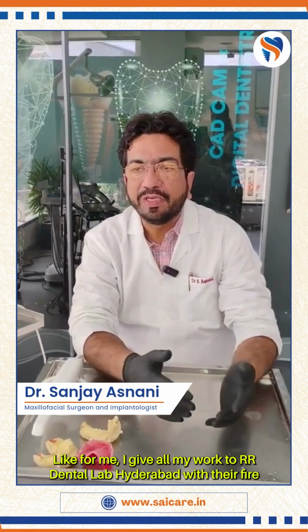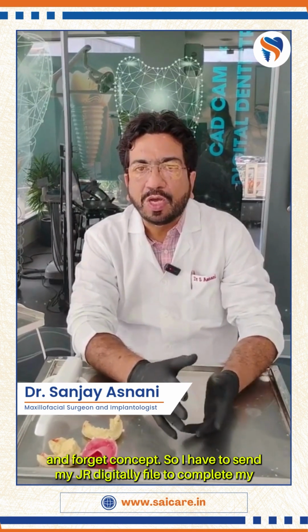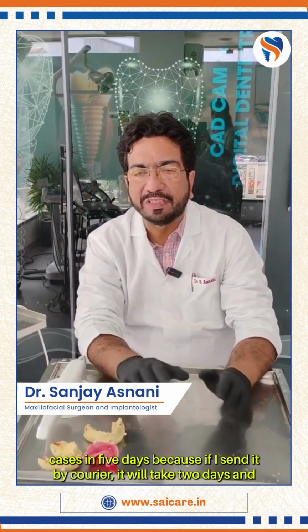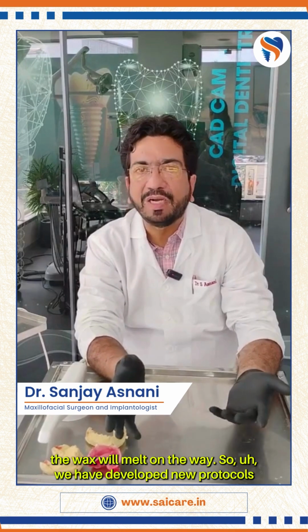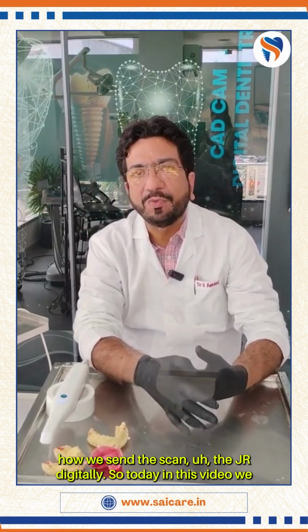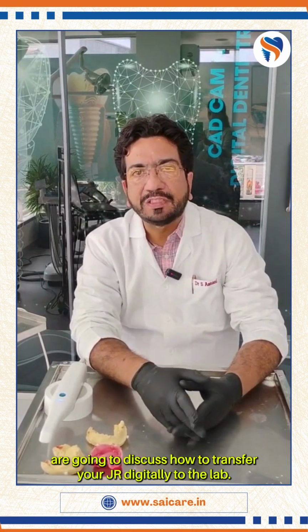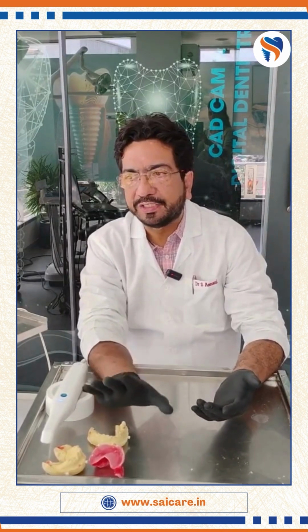Like for me, I give all my work to RR Dental Lab Hyderabad with their fire and forget concept. So I have to send my JR digitally if I have to complete my cases in 5 days. Because if I send it by courier, it will take 2 days and the wax will melt on the way. So we have developed a few protocols for how we send the scan, the JR, digitally. So today in this video, we are going to discuss how to transfer your JR digitally to the lab.